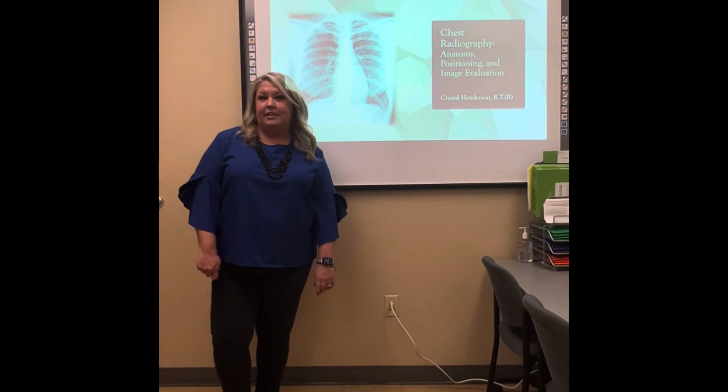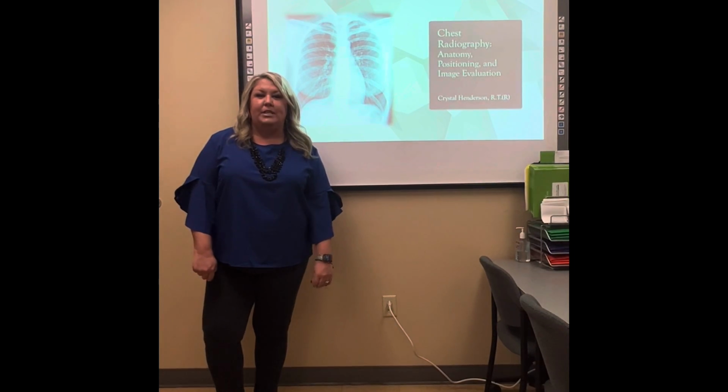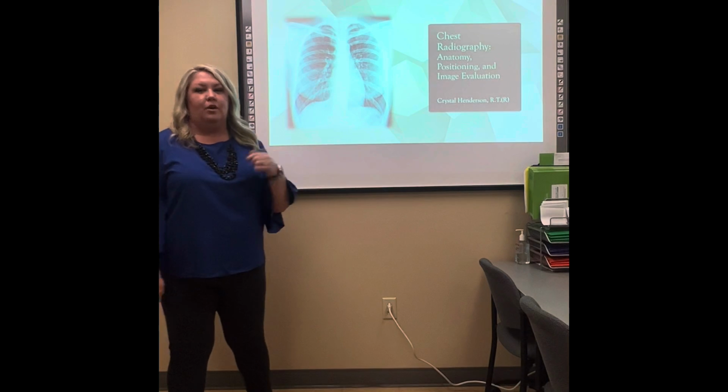Today I'm going to do a teaching demo for you over chest radiography. We're going to first go over the anatomy of the chest and then go into the lab and work on positioning, and then we'll come back here to finish up about image evaluation. So first, let's go over the anatomy.